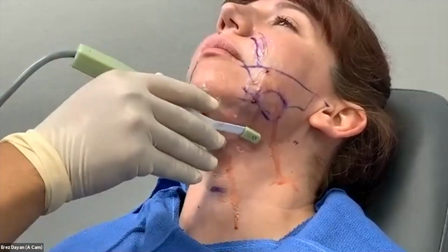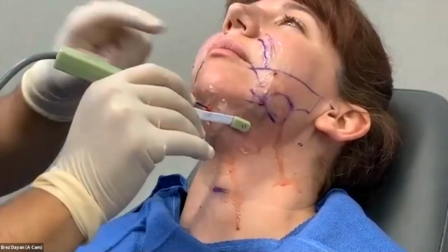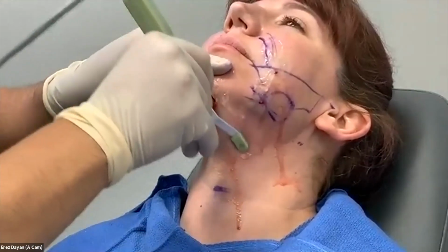Now, if you take a break, like I'm just doing right now, you will have to kind of reset the clock because things will get cool and you kind of have to consider that, which is fine. There's no problem in kind of retreating an area.